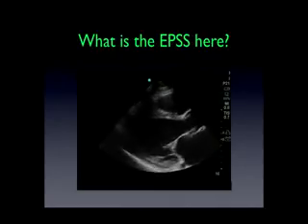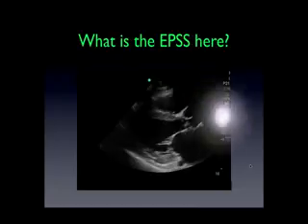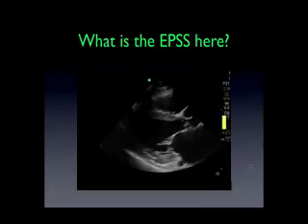Well, let's take a look at the mitral valve. The image is now frozen, and the mitral valve is sitting over here. On the scale over here, to the right, going from the top of the screen down to the bottom, the scale is set so the depth is 16 centimeters. Each hatch mark from here to here, from here to here, and so forth, represents 1 centimeter. So this yellow bar is showing a 2 centimeter separation.